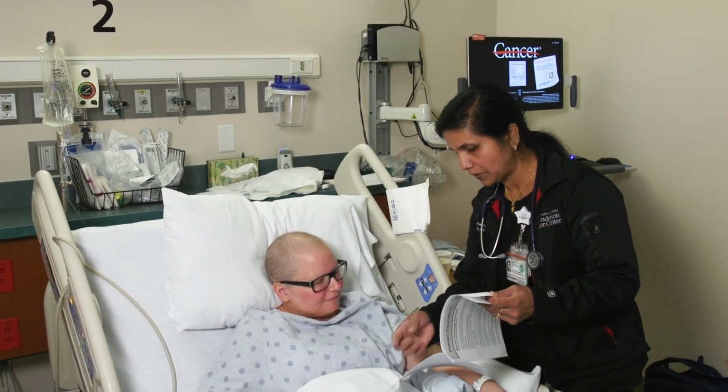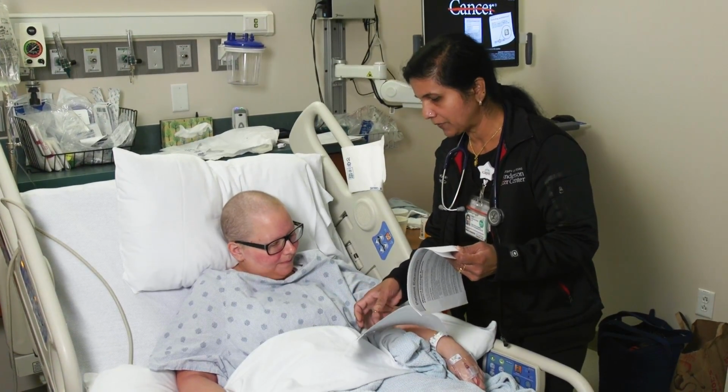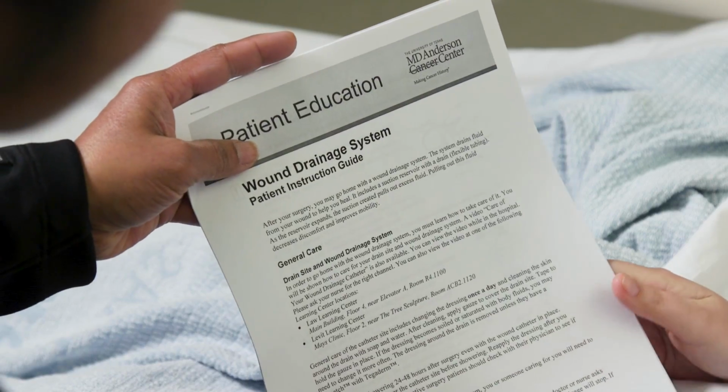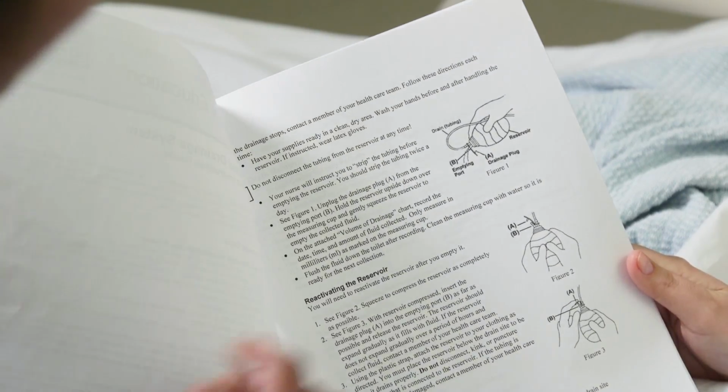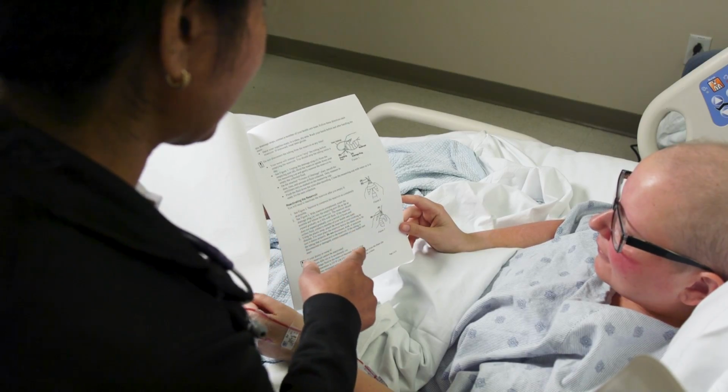Before you leave the hospital, you will be given all of the supplies and information to properly care for your incision, drain, and drain insertion site. It is very important that you carefully follow these instructions. You may find it helpful to write down your questions and concerns.